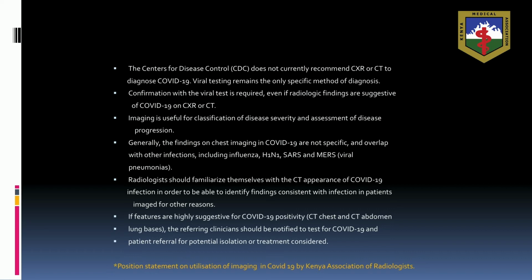If features are highly suggestive of COVID-19 positivity on CT chest and CT abdomen, lung bases, then the referring clinician should be notified to test for COVID-19. Patient referral for potential isolation or treatment is considered. This brings me to the point of incidental findings.